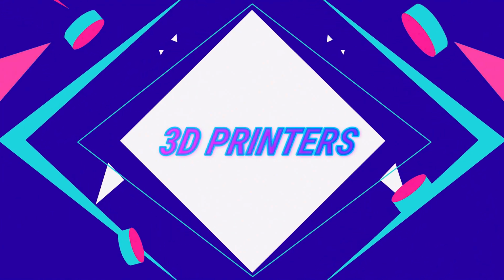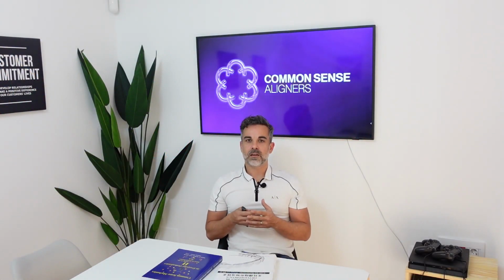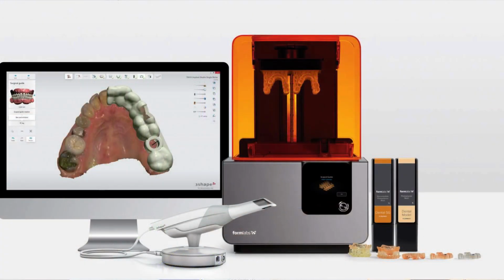Last part of hardware we're going to cover today are 3D printers. 3D printers are important today because simple things like Michigan splints, we can print them directly with a perfect fitting in our patients. And this is saving time, and this is saving money for our office and for our patients, because we can have the device on the same day. And probably in 5 or 10 years' time, we will be able to print aligners directly in our offices.